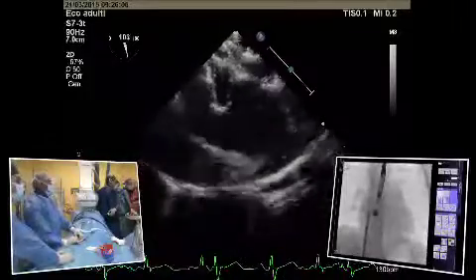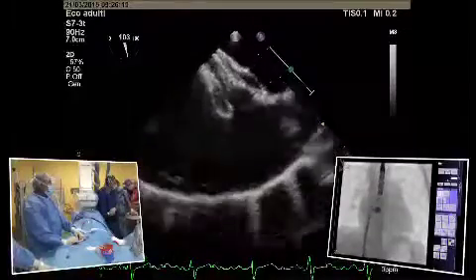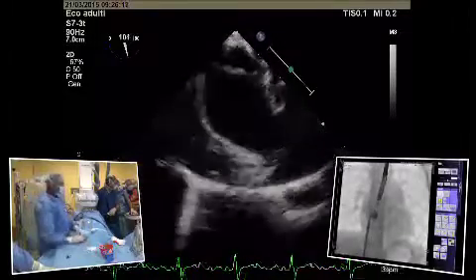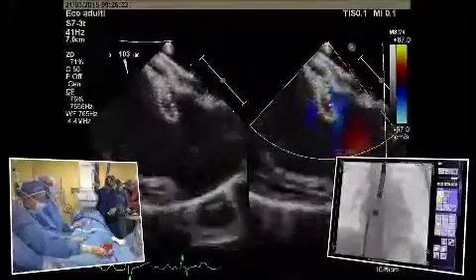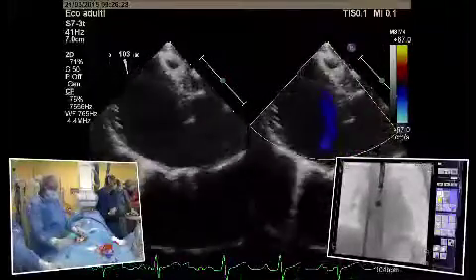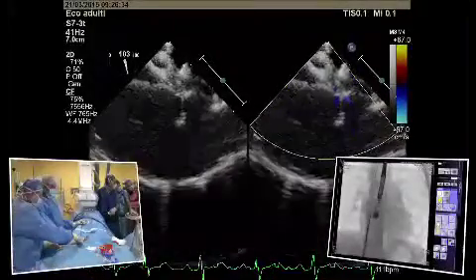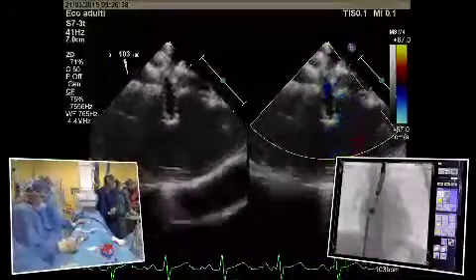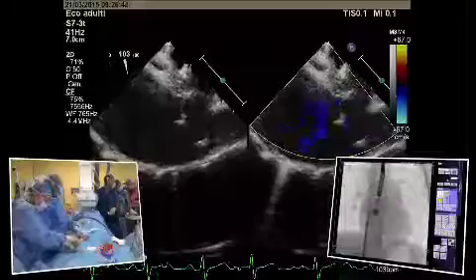Yeah, that's better. I'm pulling the device, doing a push and pull test, the Minnesota Wiggle or whatever you call it. Okay, that's fine. Looks like even posteriorly it looks fine with both the right disc too. Aki, any comments on the device position and the flow? Since you still have the wire connected to that, I think it's going to tilt back to the position that we want once you release the device.